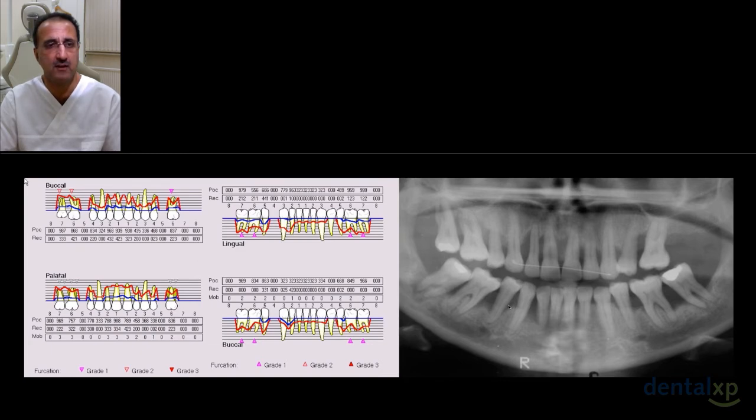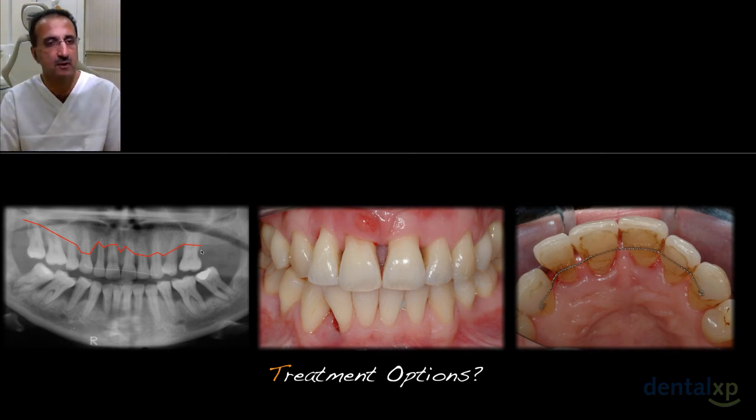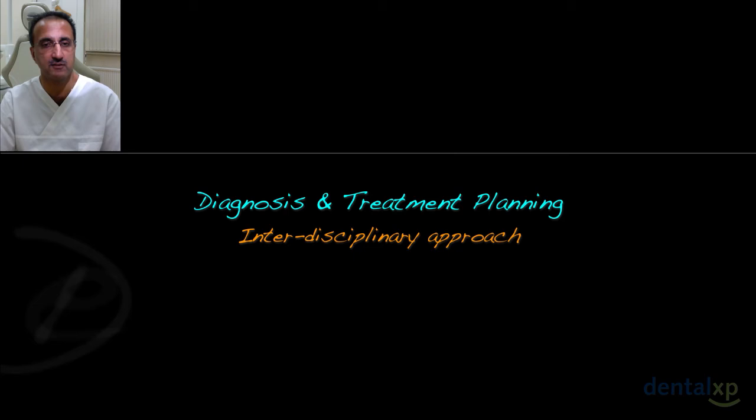And how do we manage the patient with this kind of asymmetrical bone loss? If we extract everything, we lose a lot of volume. We are for sure then going to flatten the ridge, place implants, and do prosthesis with pink prosthetic material. And I'm not sure that's necessarily the best approach for a patient with this kind of history, given her age and her desire to try and restore as much as possible her original dentition. But certainly that's an approach we could utilize, but we'll present what we did, and I think it's an interesting approach.